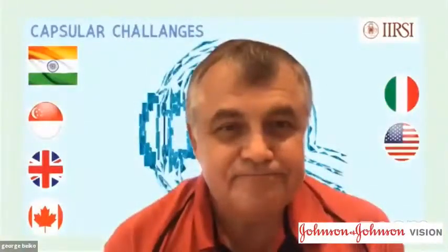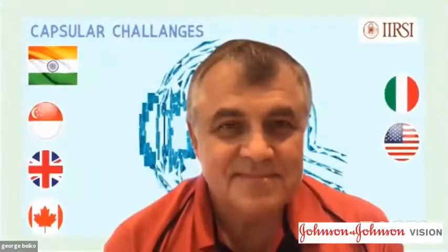8 degrees. In my experience, I am now implanting more than 90% trifocal IOLs in my cataract patients, and I don't remember having any problem with tilting of the IOL. I am implanting this IOL also after posterior capsule opening, and also in the sulcus. So I think this is relevant for some cases where the surgeon, after a complication or with difficulties, has not had the opportunity to take care of the tilting. But if you try to manage it at the end of the case, I don't think it is really significant.